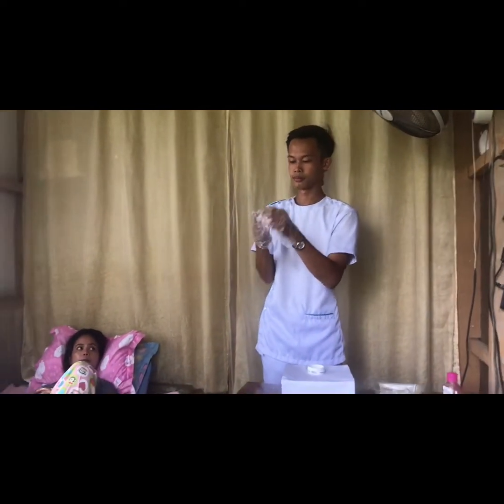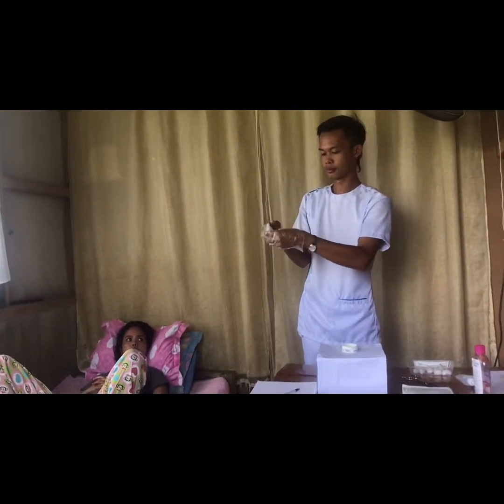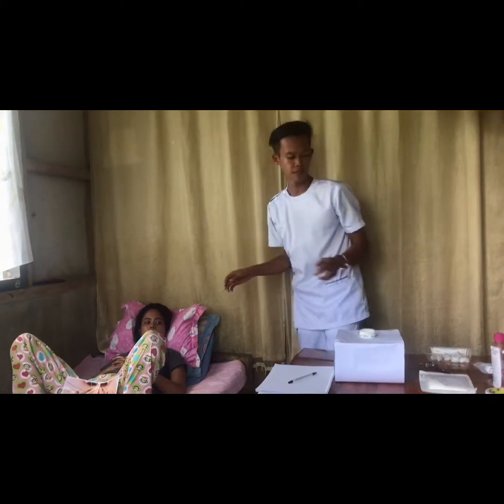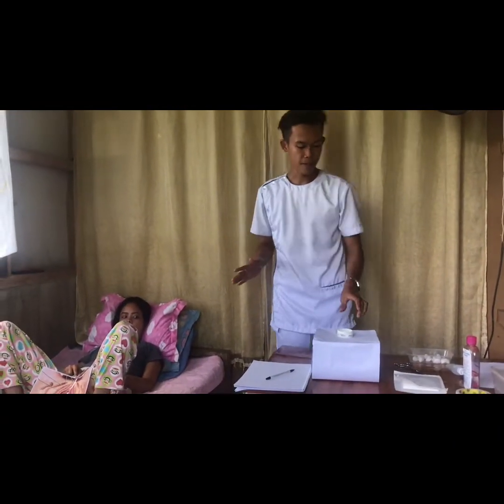So after we are able to perform the pericare for the patient, I'm going to remove my working gloves. And then after that, I'm going to dispose of them immediately. Okay. So after the pericare, the next thing that we're going to do is to open the catheter that we have.